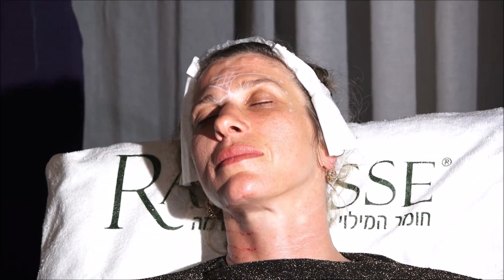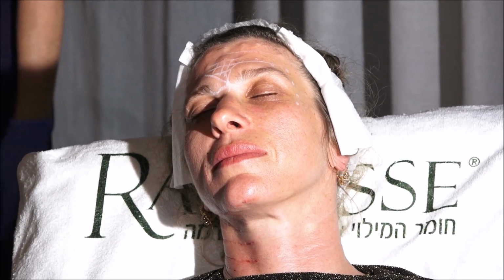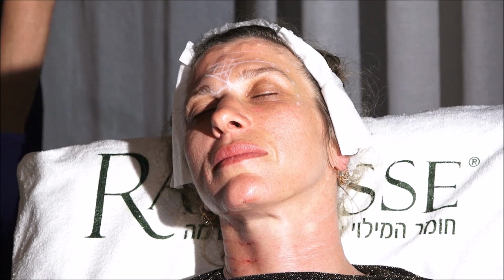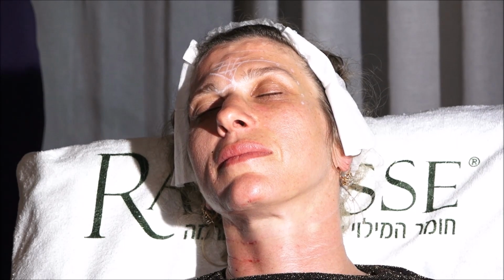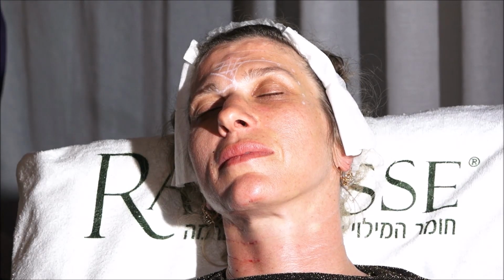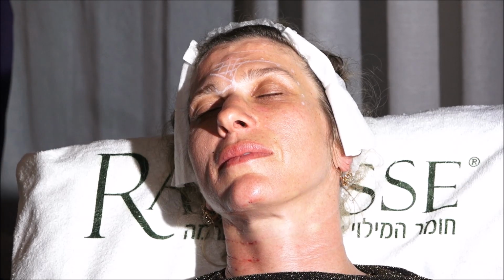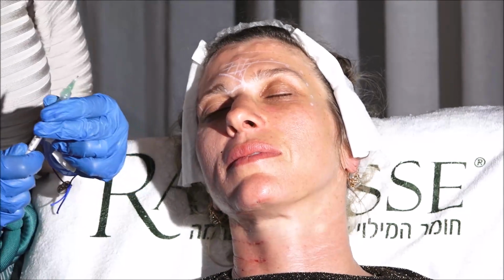Dilution by half. Let me take a little bit more of this, and then I go for that one. I'm putting this like that. This is to 1, right? This is by half. Yeah, half. By 0.5. Yeah. So let me do one thing. Still a little bit? No, nothing. Yeah. I took everything, okay. That's fine. We do the glabella first, and then I do the other side.